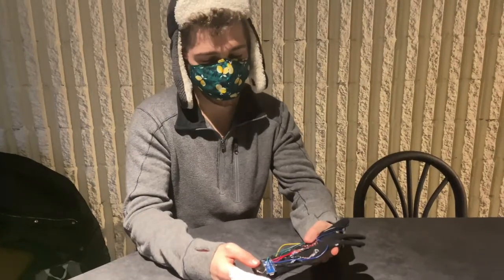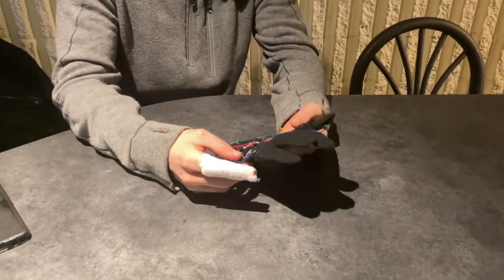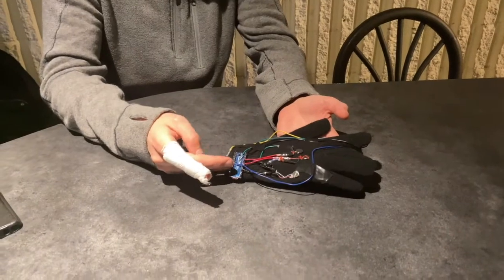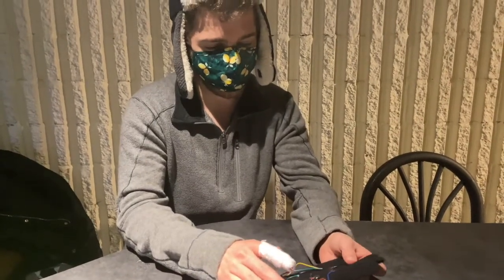Our first priority is user satisfaction. So ideally, our first improvement we would make would be to increase the comfortability of the glove and make it more fashionable. Say we sew the wires in, we use a smaller board. Overall, all the electronics would be covered so they can wear it in daily life and not get looks and not get asked questions about it.